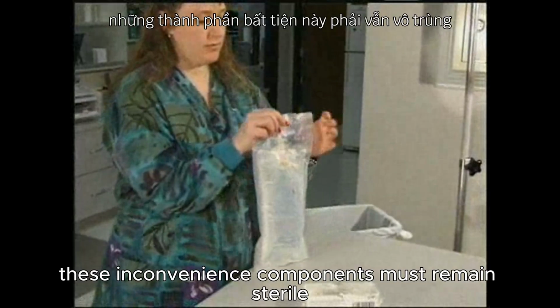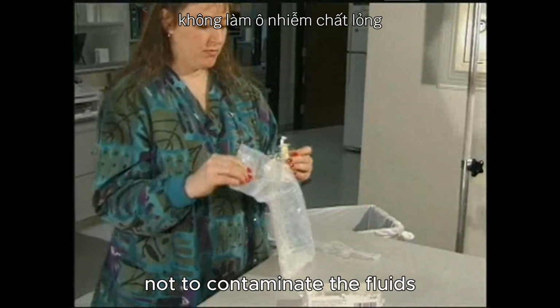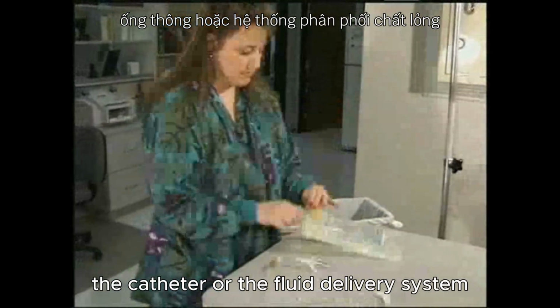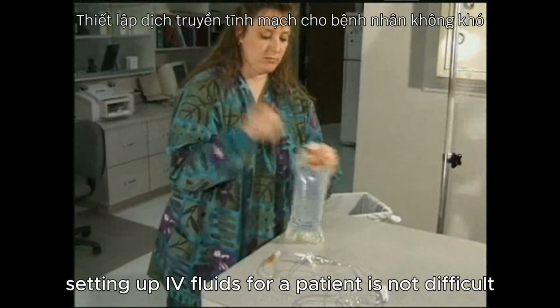These intravenous components must remain sterile, so the utmost care must be taken not to contaminate the fluids, the catheter, or the fluid delivery system. Setting up IV fluids for a patient is not difficult.